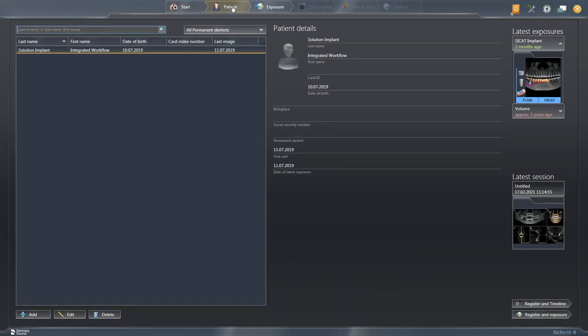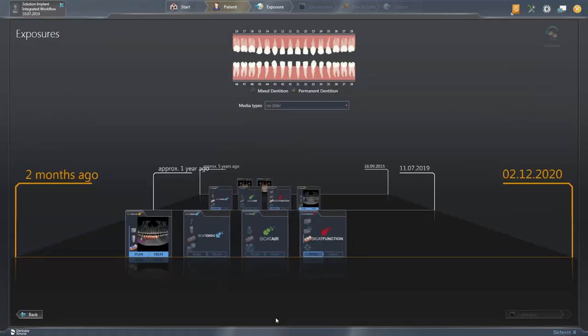In our patient table, there is currently only one patient case and with a double click, we get to the timeline in which all media items and patient sessions are saved in chronological order.